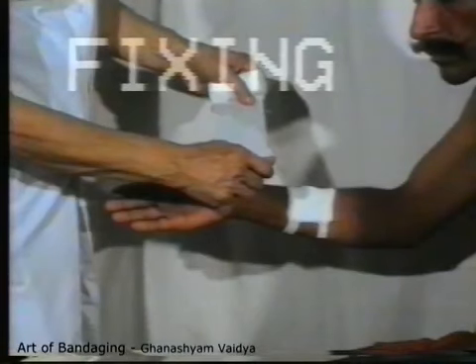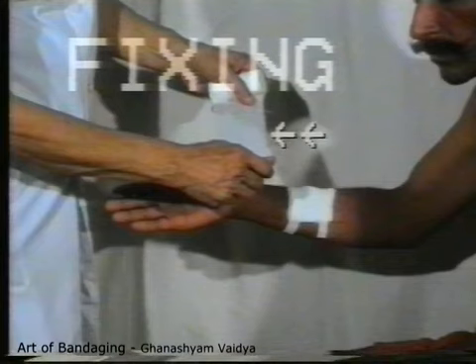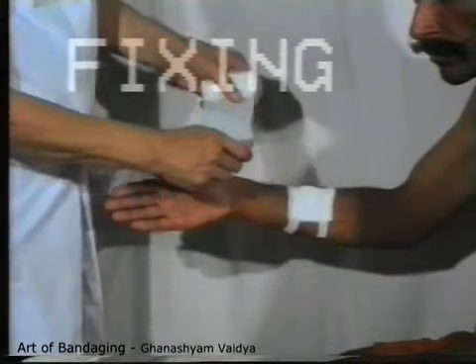First, select a bandage of suitable size. To bandage the right side of the patient, stand on his right side and hold the bandage in your left hand. Unroll a few centimeters of the bandage and hold the end over the outer aspect of the limb. Note that the outer surface of the bandage is applied to the skin.